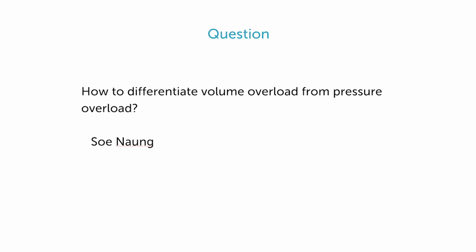Please, go ahead. First, what you have to differentiate is an acute and a chronic state. Let's think about high pressures first. What do high pressures do? The ventricle has to use more of its strength to really pump against this high pressure. So what will it do? It will become hypertrophic. Where do you look at hypertrophy? Subcostal view, and then you can see it.